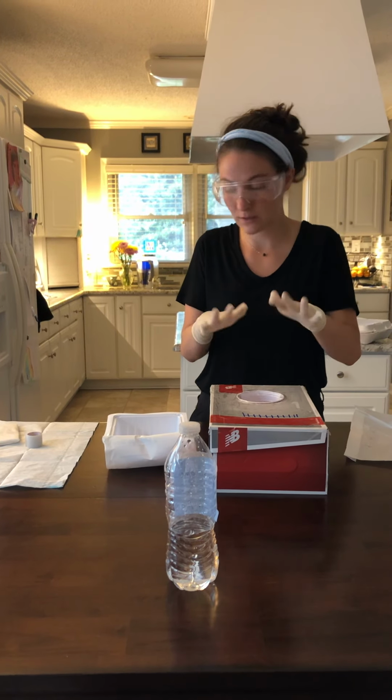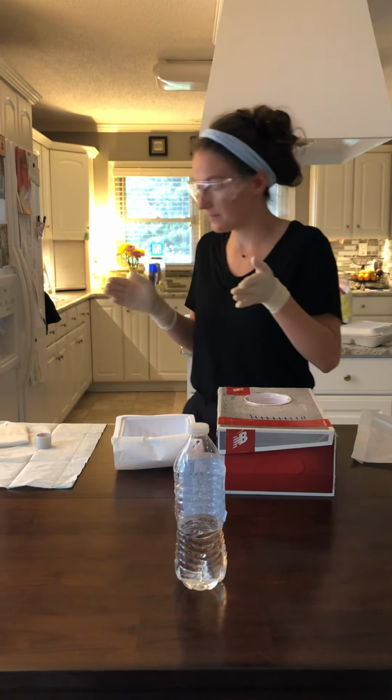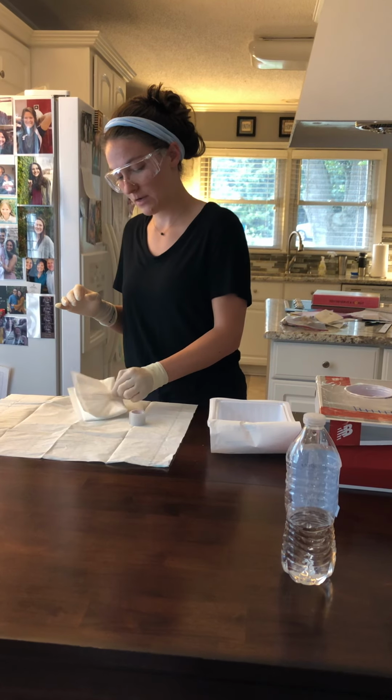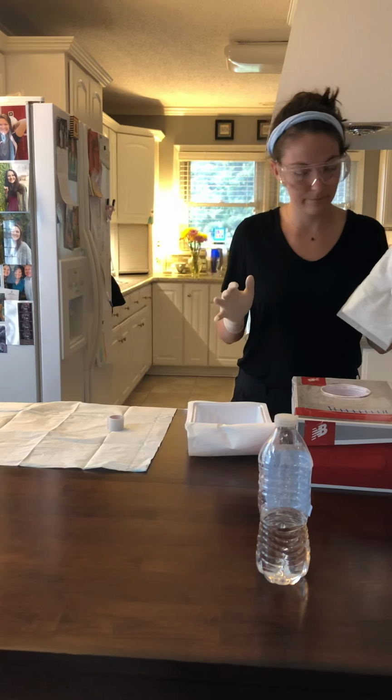So that's not too packed, but it has enough in there. Then I'm going to use my ABD pad and lay it over the top.